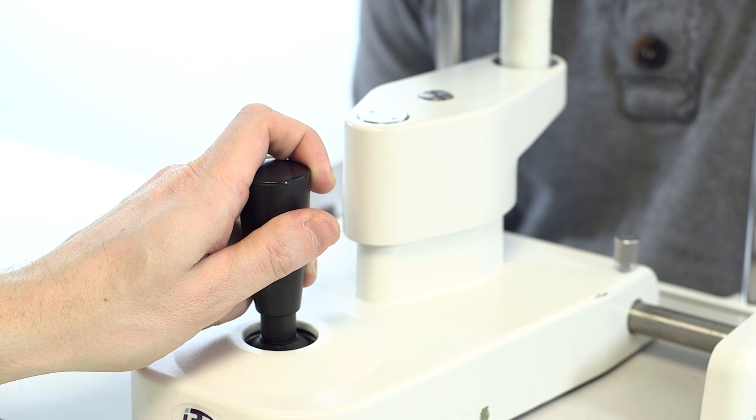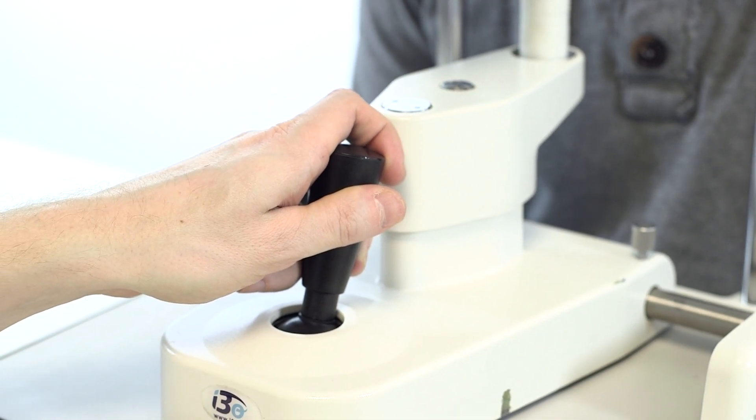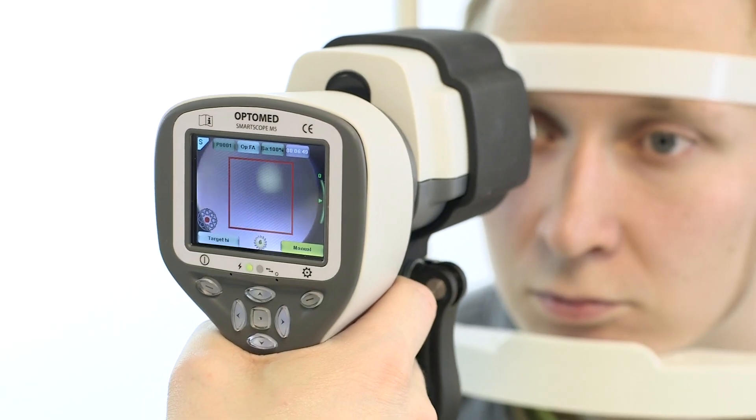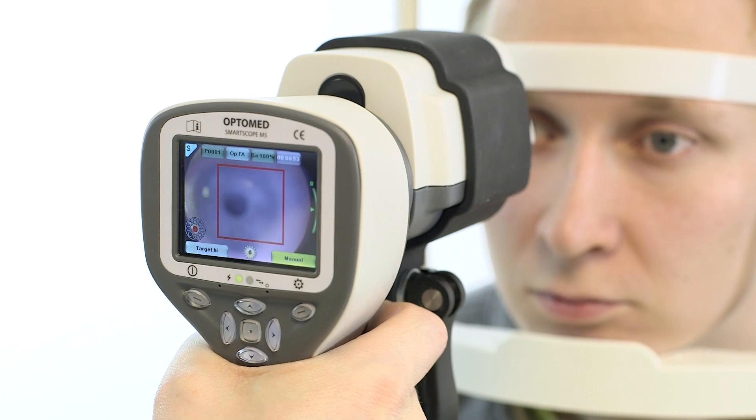If adjustment is needed to re-center on the pupil, use only very small movements as it is easy to lose the target. If the view is lost, just withdraw the camera a few centimeters and re-align to the pupil.